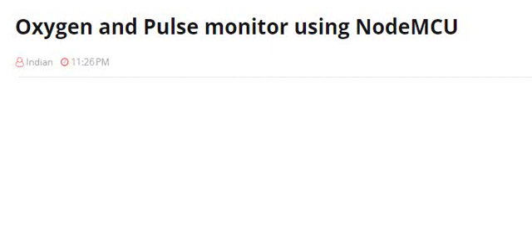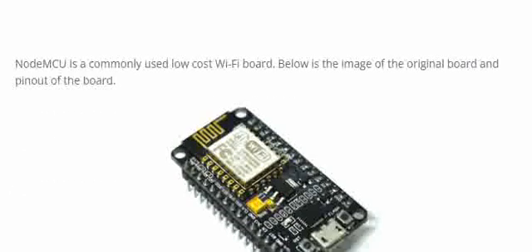Hello all, let us see how to do Oxygen and Pulse Monitor using NodeMCU.